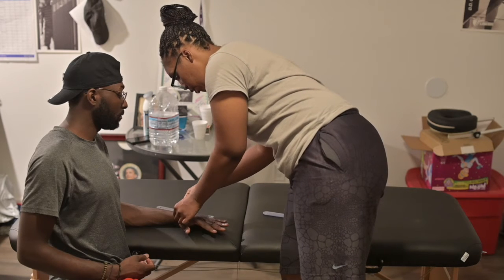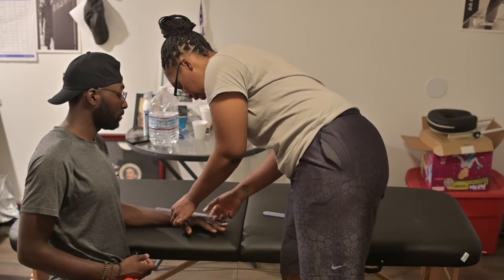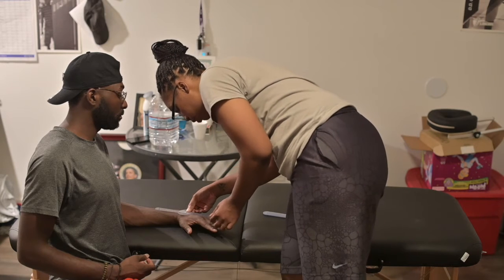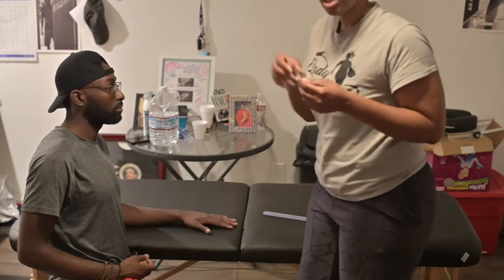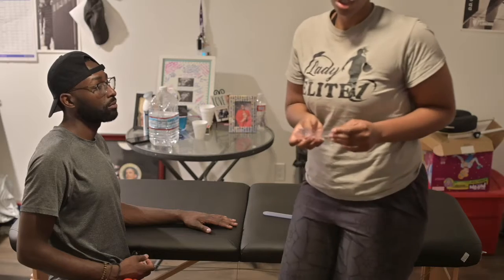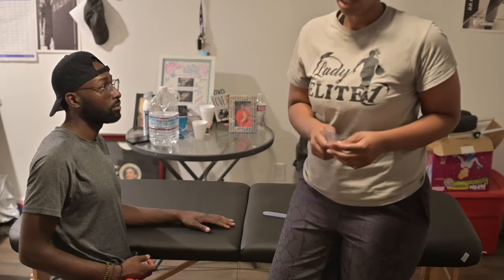Okay, so let's keep that in the center here. So Sanford is measuring at 19 degrees of range of motion of radial deviation motion at the wrist.